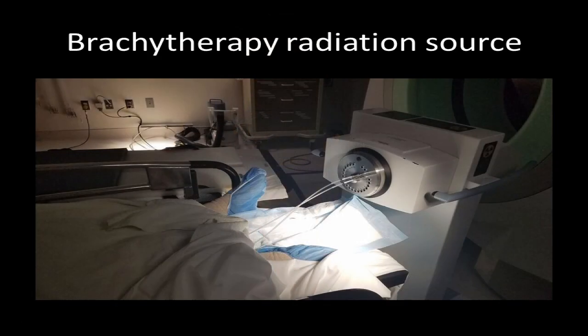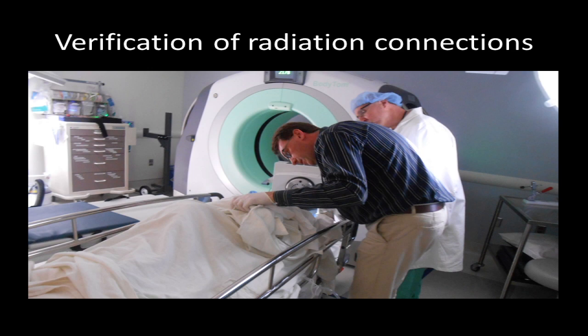Once your physician has finalized your brachytherapy plan, you will be transported to a procedure room where you will be continuously monitored using voice and video surveillance. This helps ensure your safety and comfort during the delivery of radiation. A brachytherapy radiation source will be connected to your implanted brachytherapy applicators, and the physician and radiation physicist will check the radiation tubing connections for security.